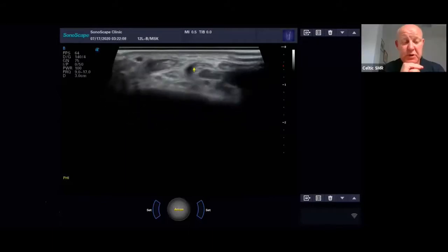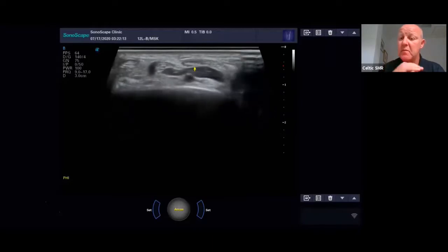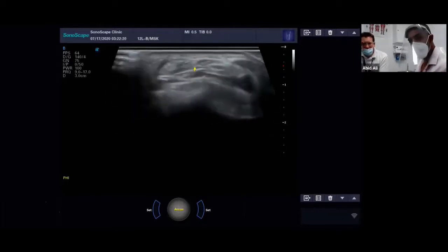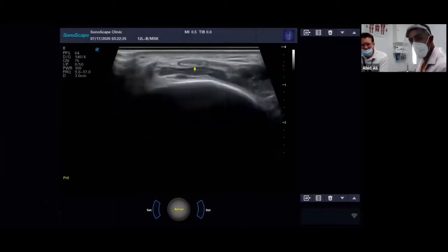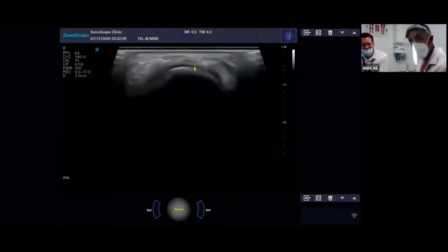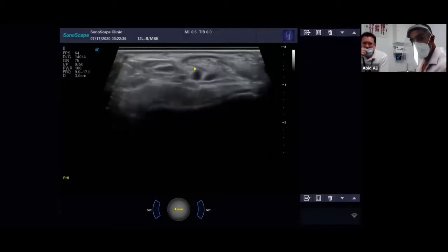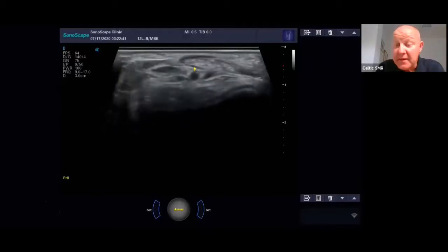Abid, do you ever use standoff gels for the sore parts when you're scanning down there? Yeah, we have that. What's that block thing called? Oh, you mean a physical standoff? We don't have them in the hospital, but you can buy standoffs that you can use to scan, or you can just use a load of gel as a standoff, or, as someone said last week, you can put the foot in water if your manufacturer allows that. Yeah, that did come up the other week, didn't it?